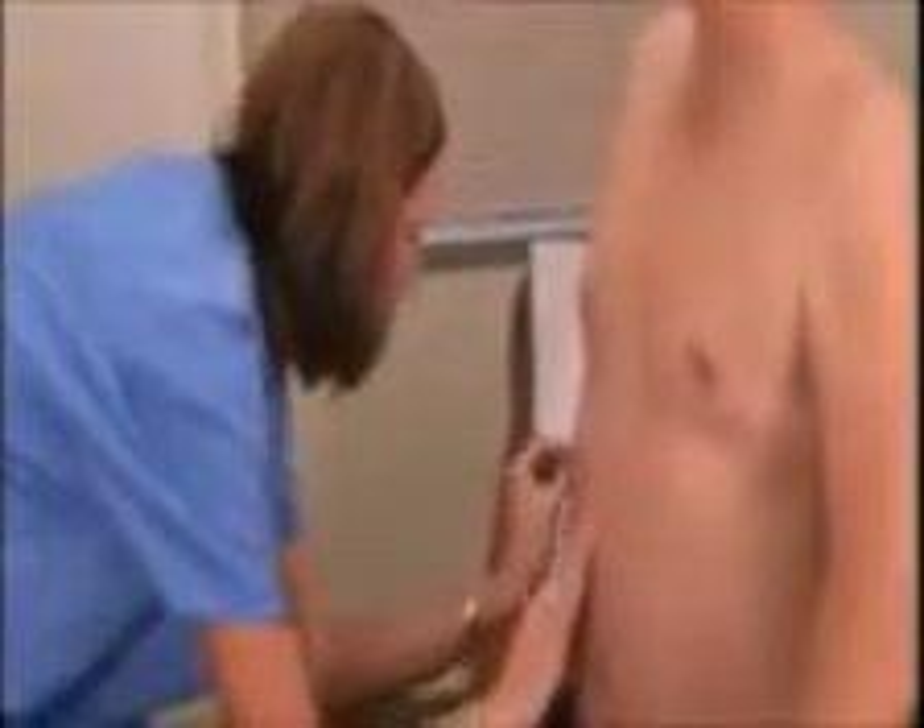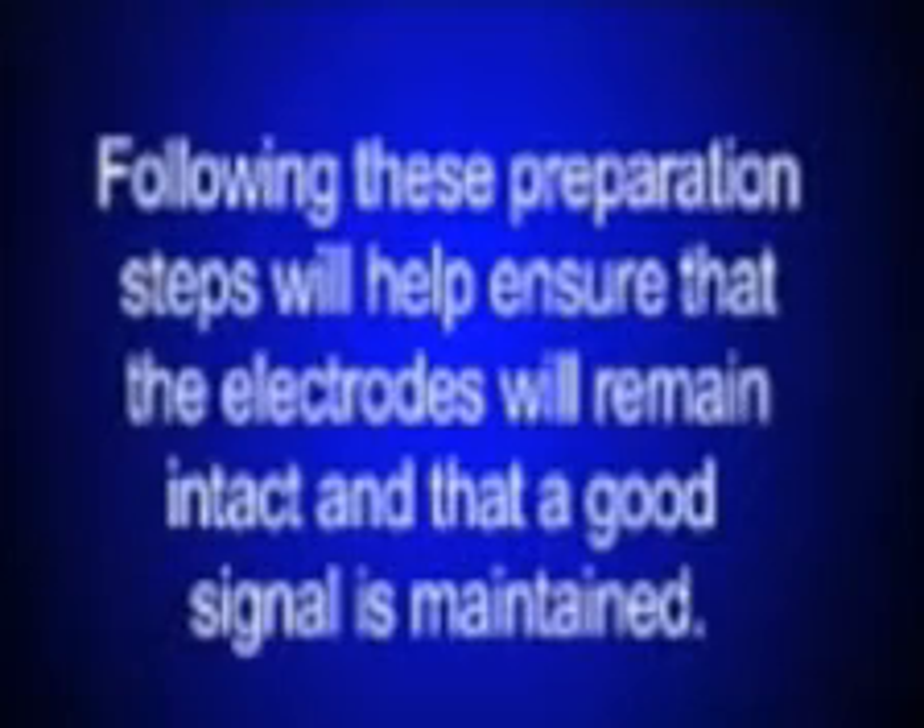Cleanse the electrode sites with the included alcohol pads. Before applying the electrodes, make sure that the prepped area is completely dry. The electrodes need to stay in place on the patient for at least 24 hours. Following these preparation steps will help ensure that the electrodes will remain intact and that a good signal is maintained.